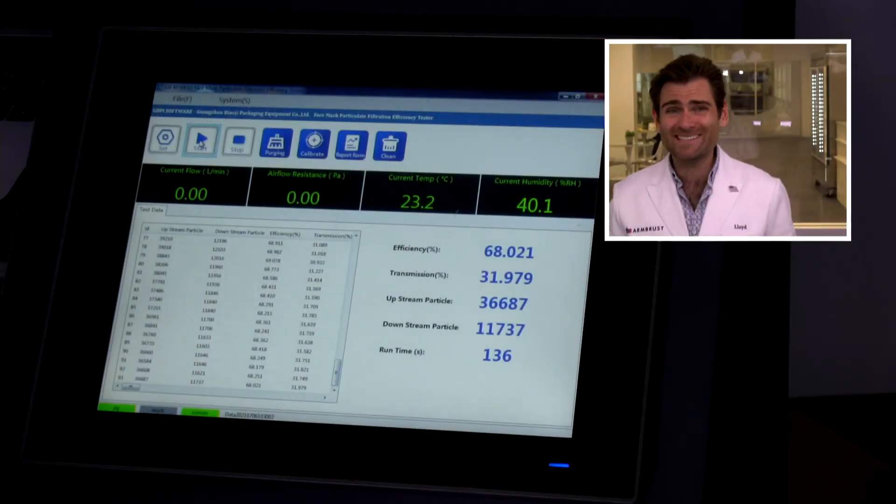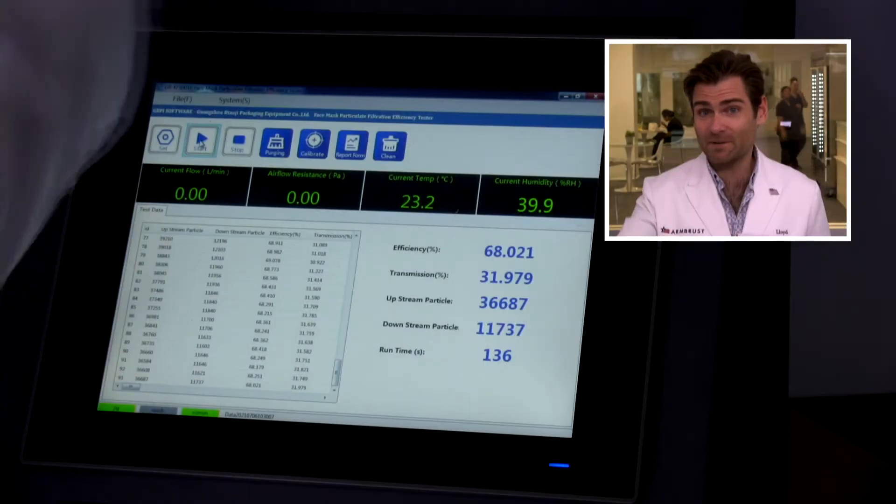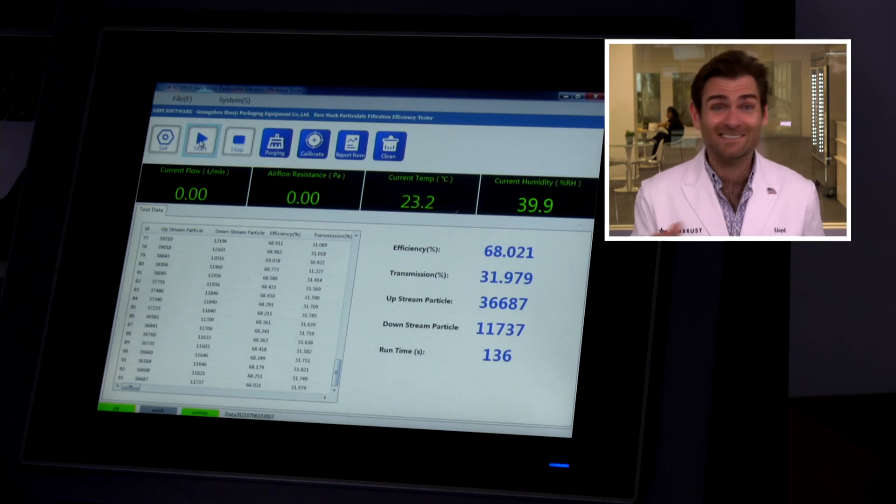PFE of 68% — 68.021. Not ideal. Now, caveat: apparently according to the box, which is the first time I'm reading it, the Indian standard below class three has nothing to do with this machine. I would be very surprised if this is going to pass at 98% as it claims on the box when the PFE is coming in at 68%. But according to the Indian standard, I guess it may pass — I can't really call them out on that. However, I would not trust this mask personally. I would not wear this mask — 68% is too low for me.